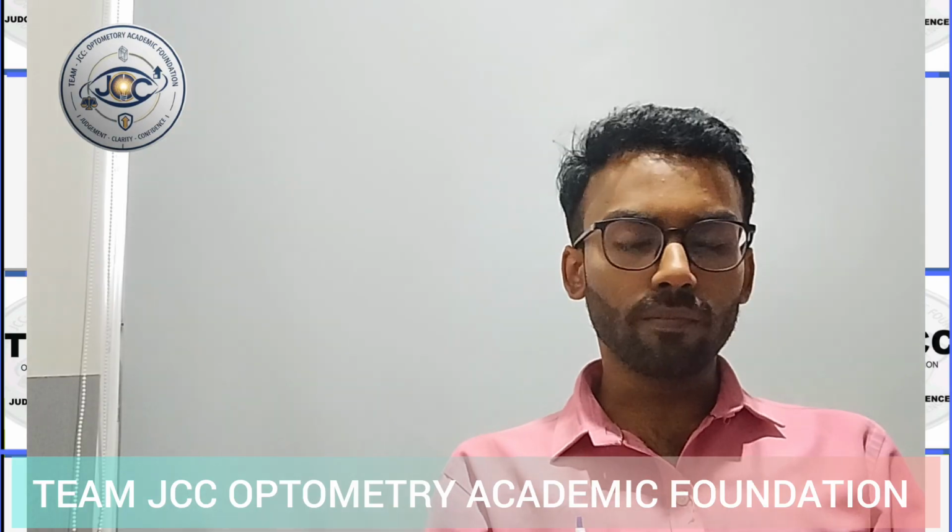So what kind of question may come from here? They can give you the picture to identify the condition, or ask for the diagnosis in this condition, and remember the location where fluid accumulates. In CSR, central serous retinopathy, fluid accumulates between the RPE layer and the neurosensory retina, in the subretinal space. But in cystoid macular edema, I mean diabetic macular edema, the fluid accumulates between the outer plexiform layer and the inner nuclear layer.